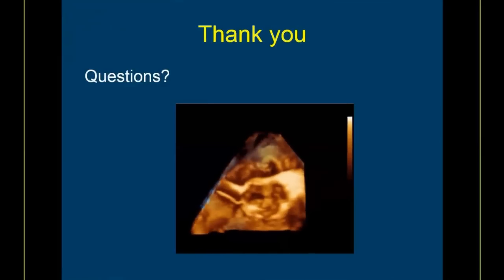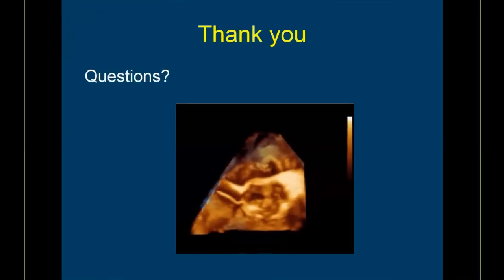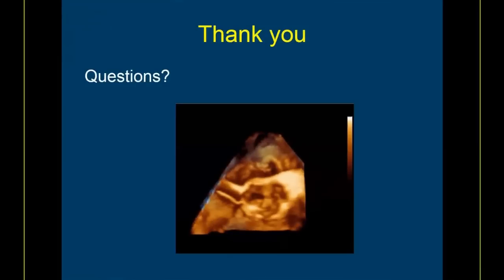That's often the time when you might want to do a catheterization to get the gradients and calculate aortic valve area. Another situation may be in pressure recovery situations. But again, pressure recovery in general is not common. Where you will see it is in the setting of prosthetic valves, small aortic valves, and small ascending aortas of less than 30 millimeters. In the adult population, that seems to be less and less common as we deal with more aortic aneurysms and dilated aortas.